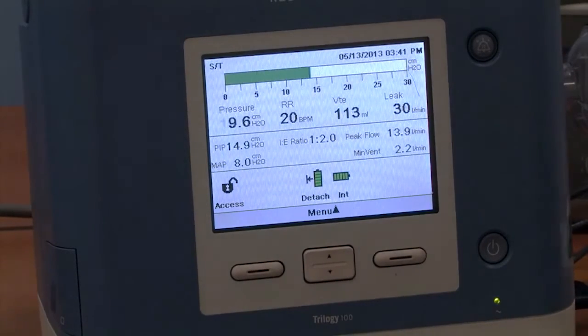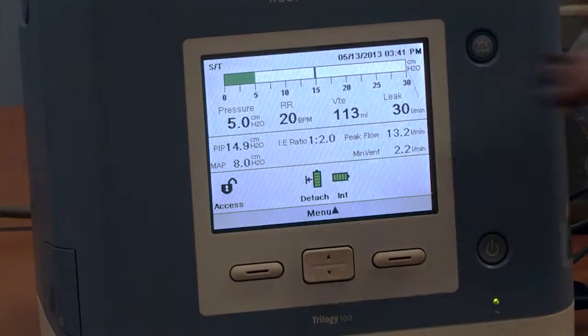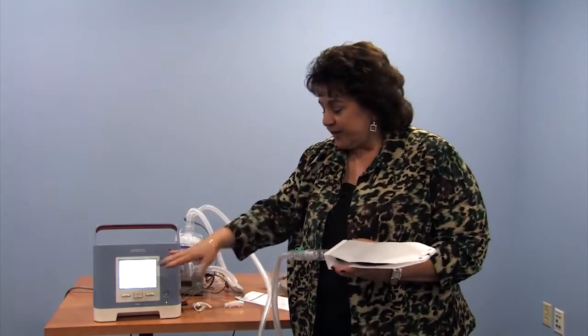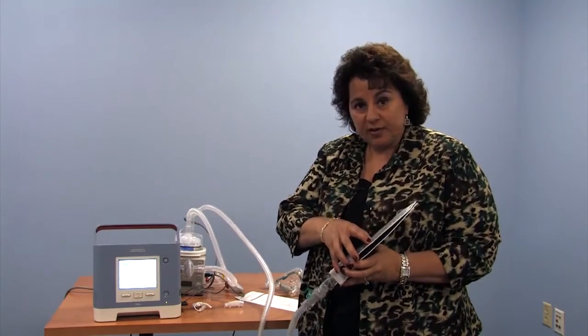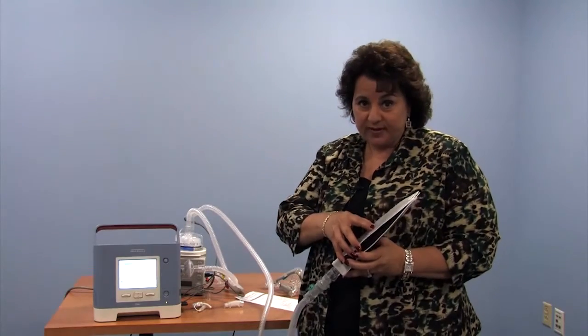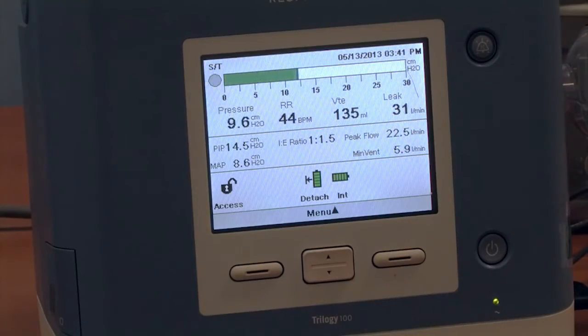So right now, this patient is getting breaths, getting pressure support or BiPAP breaths, but they are not triggering them themselves. And we'll review the settings, but right now they're not taking them. So if I start assisting, there we go. So this patient can breathe as fast as they want to, but currently the backup breath rate is set at 20 breaths a minute. So if they breathe below 20, the machine will fire. So if they go to sleep, they're very quiet and calm, you'll no longer see the ball.